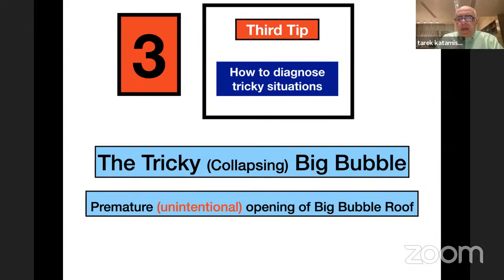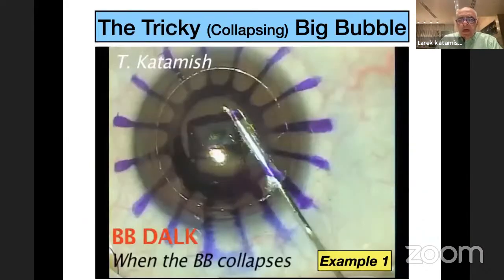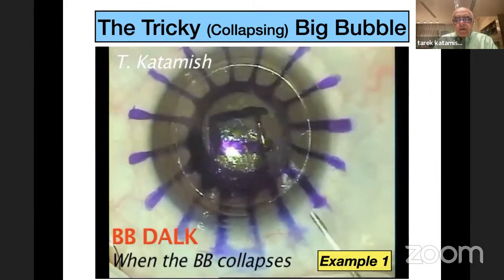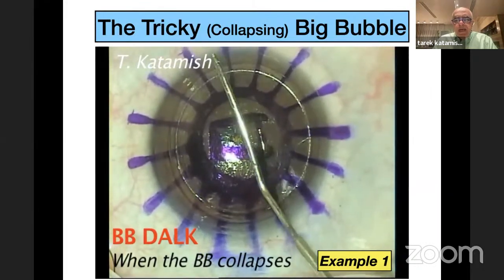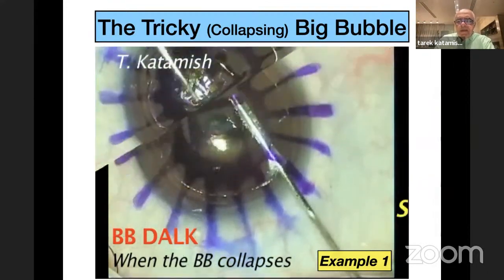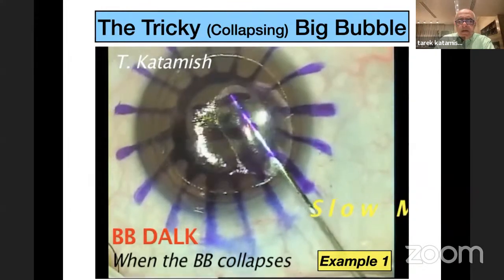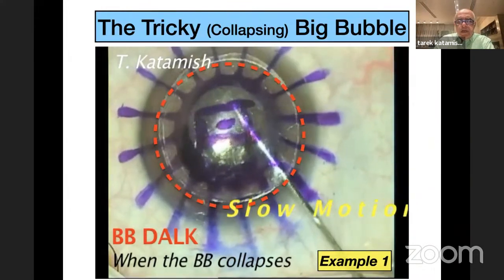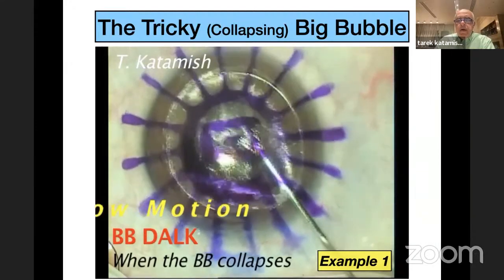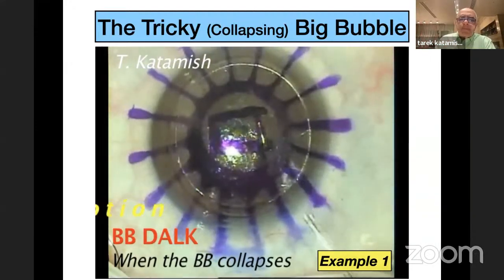I call it the collapsing big bubble, and the unintentional opening of the big bubble roof. I will show you now the collapsing big bubble. What I mean is sometimes when you inject air, like in this example, when you are going out, the air is coming out. Again, I will do it in slow motion. You see, injecting air, getting the big bubble, very well-defined edge, and then the air escapes while you are going out. So the walls of the big bubble have collapsed.